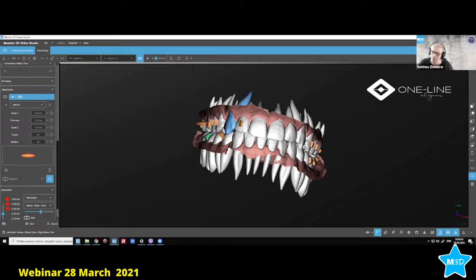What are you using for the attachments themselves? What material? Yeah, just a second. So you can see the... Yes, perfect. Can you see now? This is good. This is a hook. So this is perfect for holding the elastics. This is a 0.75 foil, yes.